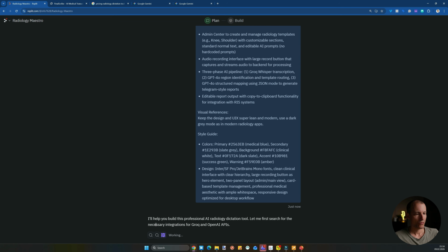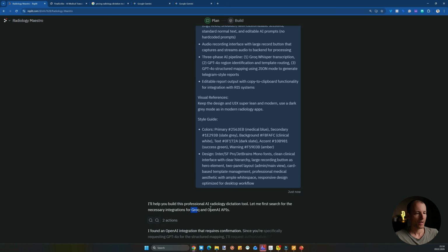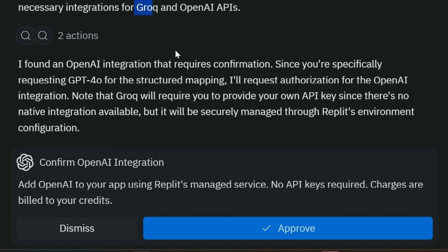So it's now checking for the necessary integrations for Groq, which we will be using for the OpenAI Whisper API, and OpenAI APIs. Now here is an important new thing. If you don't have an OpenAI account yourself, you can just click approve. You don't even need to have your own API key. This will be completely done by Replit. I don't want to do that because you lose full control over the cost and everything. So I'm going to dismiss.